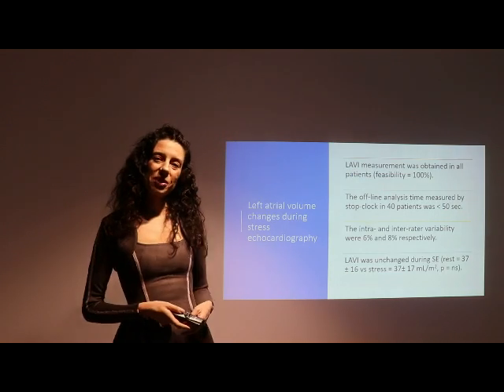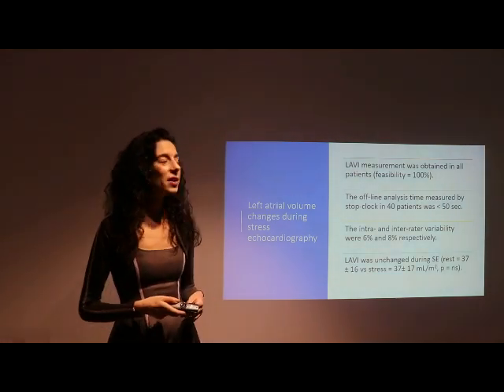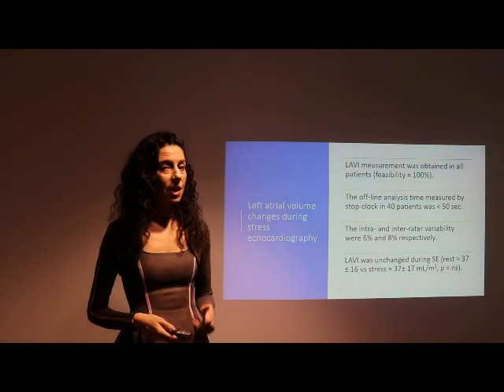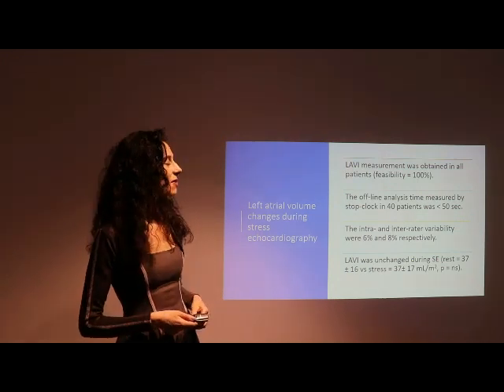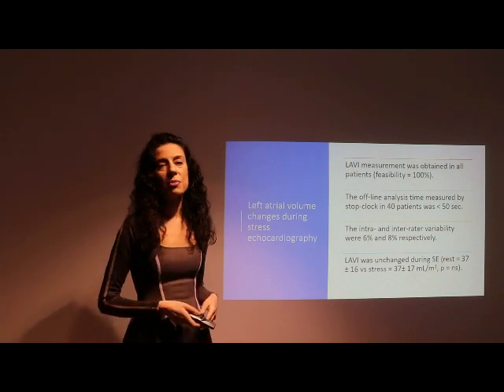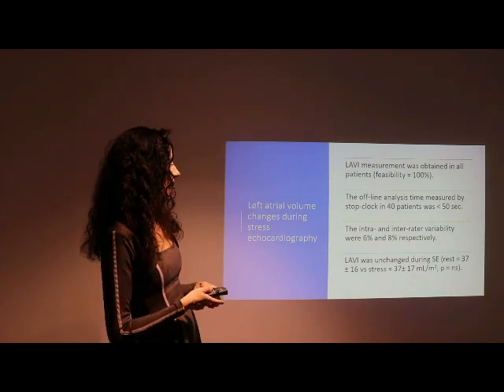So LAVI measurement was obtained in all patients, and the feasibility was 100%. The offline analysis time measured by a stop clock in 40 patients was less than 50 seconds. The intra- and inter-rater variability was very low, about 6 and 8%.